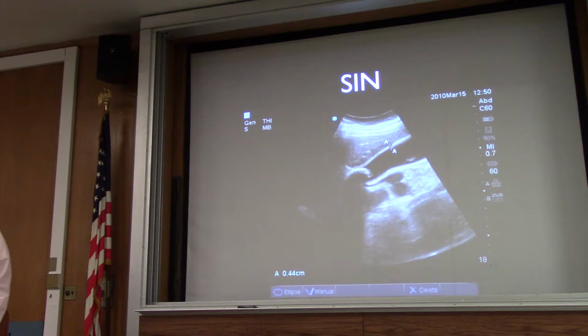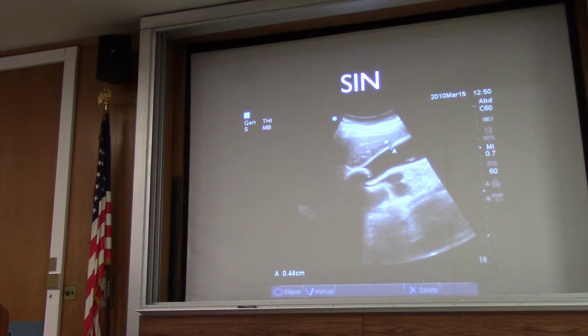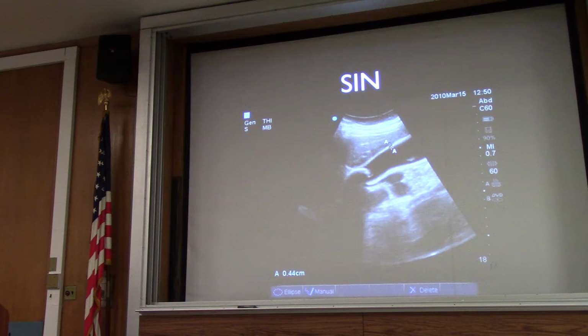I like to think of stones in the neck, especially stones this size, as eventual cholecystitis. And I think you really have to think twice about what you're going to do with this patient, just because they don't have any obvious signs of infection. When you have a stone that size wedged in the neck, you could try moving them around to see if it pops out. But these patients very often are going to eventually develop cholecystitis, and they usually have a lot of pain, even if they haven't developed the infectious symptoms yet.